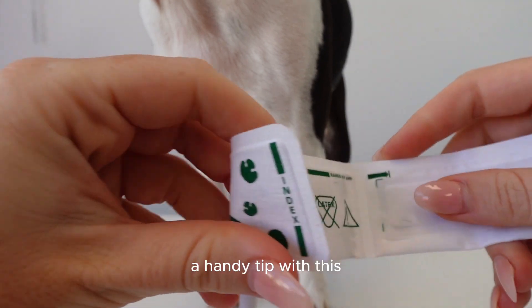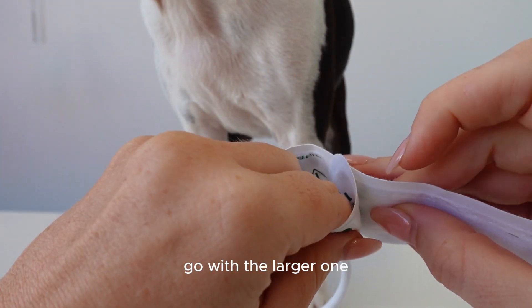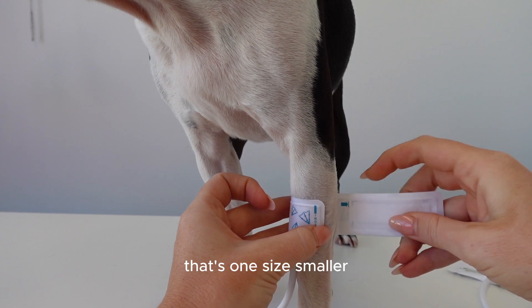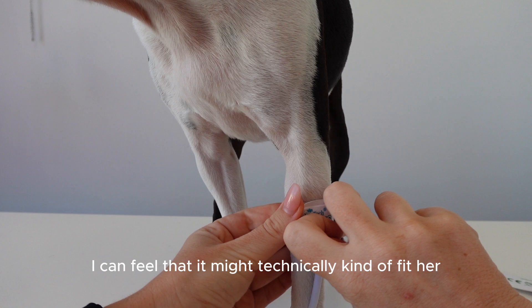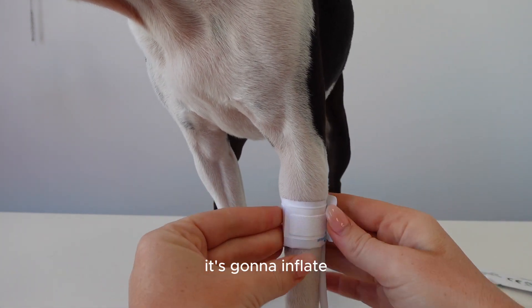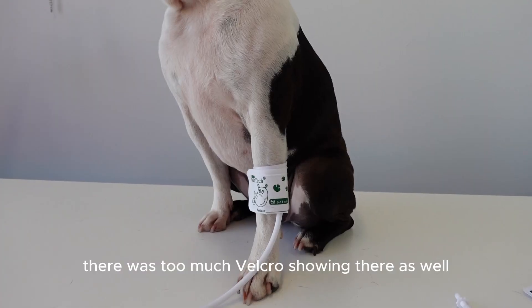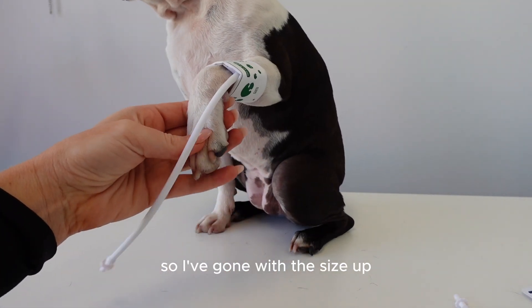A handy tip: if you're tossing up between two different blood pressure cuff sizes, go with the larger one — it will always give you more accurate readings. When trying the smaller size on Daphne, I can feel it might technically fit, but once the machine inflates it, it's just going to pop off that leg. A good indication it was too small was that there was too much velcro showing. So I've gone with the size up.